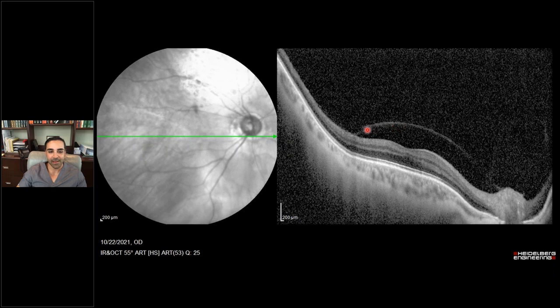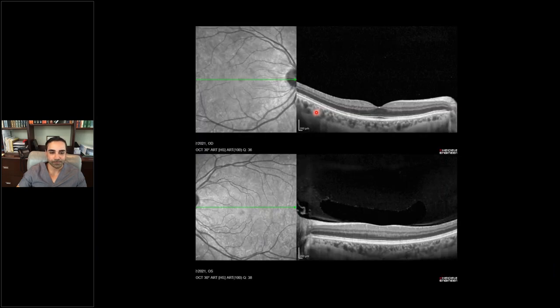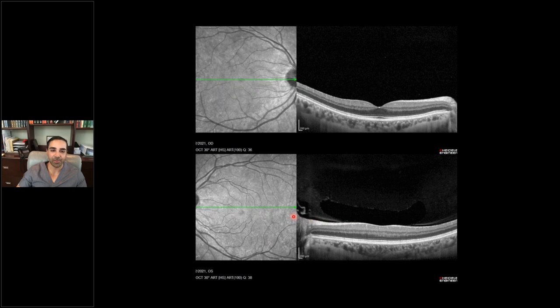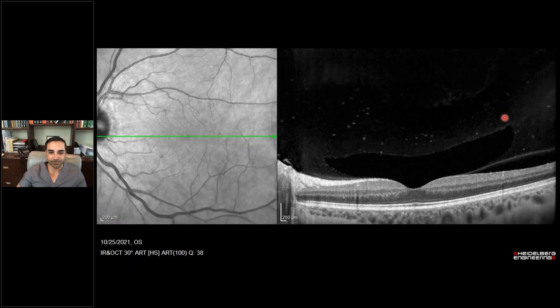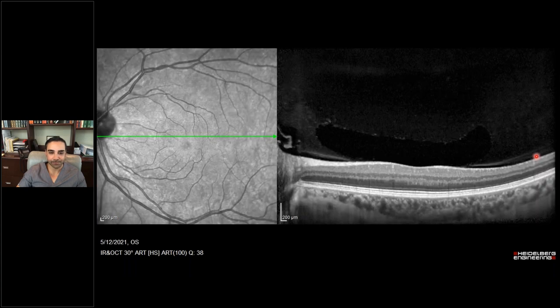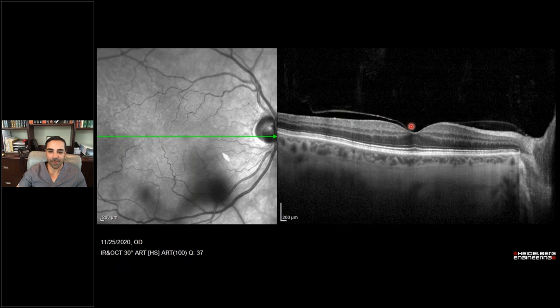Here are additional incomplete PVD examples: posterior hyaloid lifted in one area and attached at the temporal macula. Another example shows slight lifting of the posterior hyaloid. Don't be fooled by the empty space — this is the premacular bursa. You have to look at the entire macula and even the optic nerve. In the fellow eye, this eye has a complete PVD with no hyaloid remnant. Another incomplete PVD with punctate vitreous opacities. Incomplete PVD at the fovea and the optic nerve — these are two of the last areas that tend to release in the evolution of a PVD.